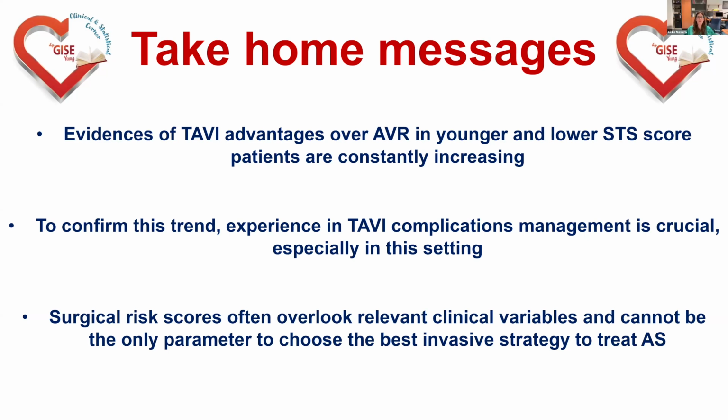You talk about NOTION 2, and NOTION 2 raises again the problem of the treatment of bicuspid patients. Do you think that, if we want to treat bicuspid patients well with a transcatheter approach, it is more a problem of the anatomy of the valve phenotype or the THV platform that we should choose?